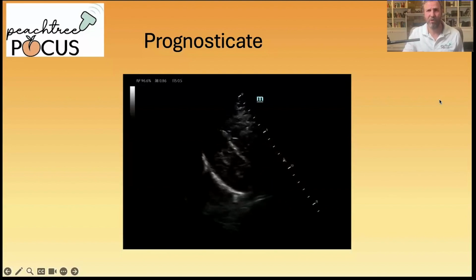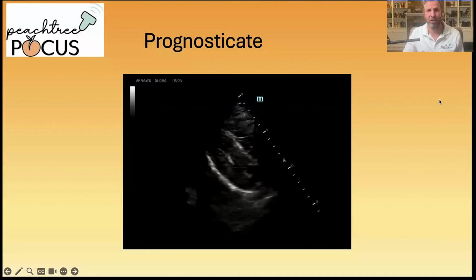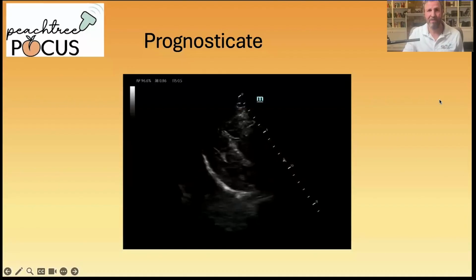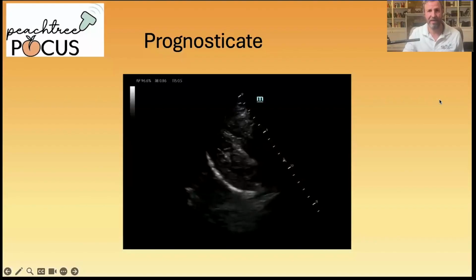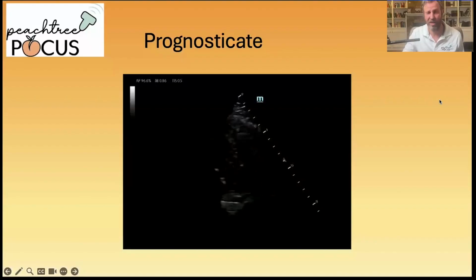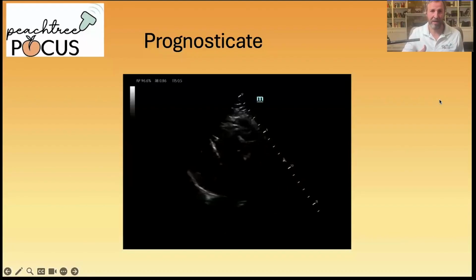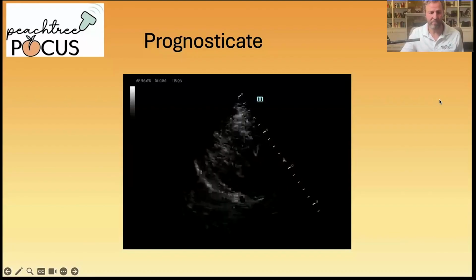And remember, this is important because trauma resuscitation is incredibly resource intensive. Ultrasound in that moment gave the team the confidence that continuing efforts would not have changed the outcome, when you really want to do as much as you can in a young patient like this.